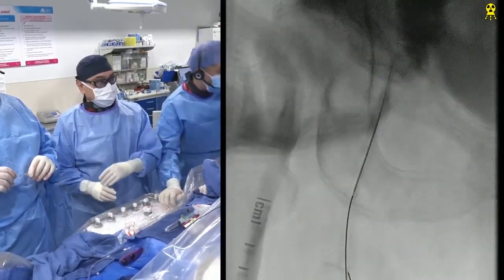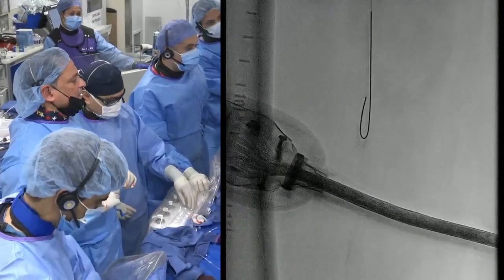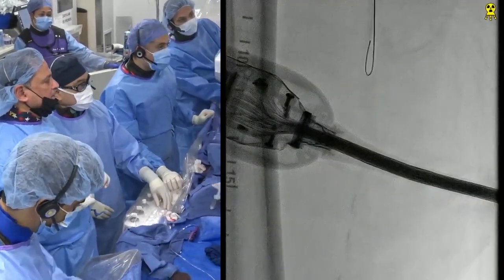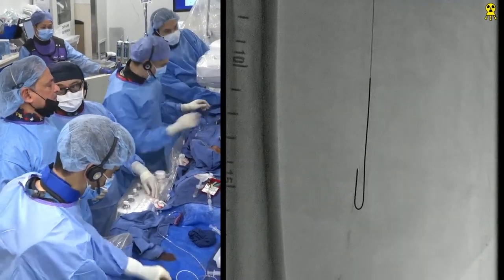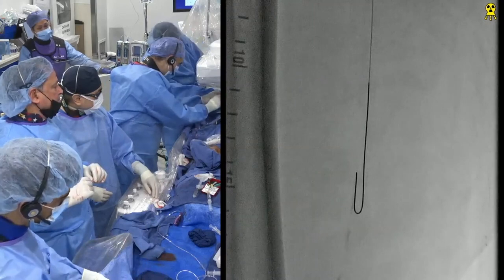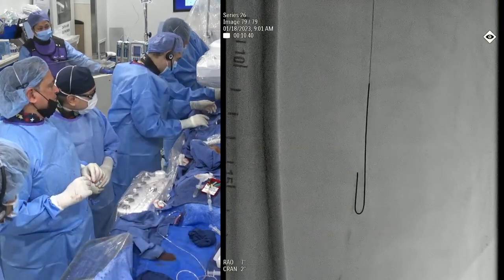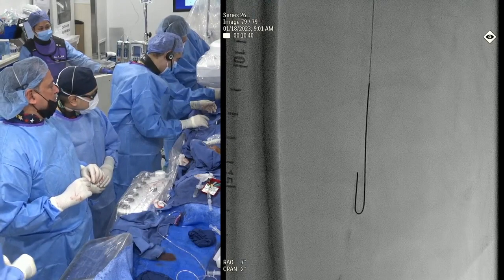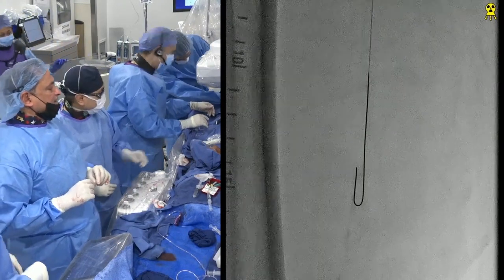There you go. There's the wire down. Okay. Yep, there it is. Going nice and easy. Yep, you come down here. Maybe you cross. Keep coming, brother. Yeah, that's just the introducer. I would love to see this wire just cross by itself. Fly through. It may, because you created such a big plane. Which wire are we going to use, though? Well, I would go with an 014 wire so you can steer it into my catheter if you can.